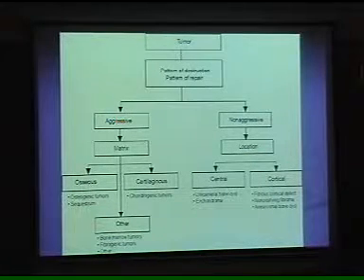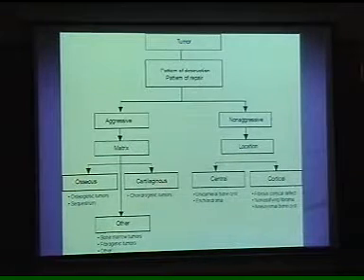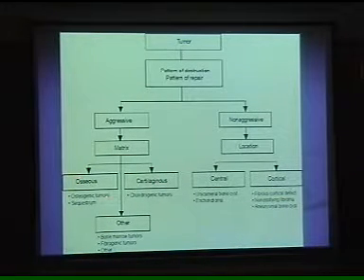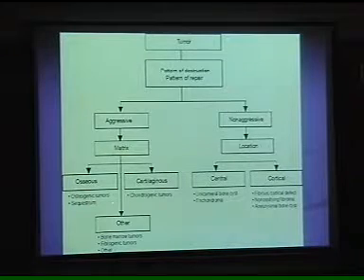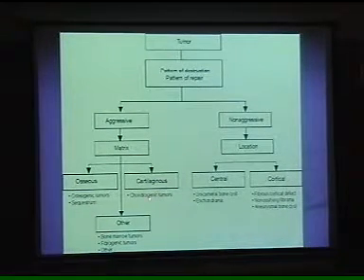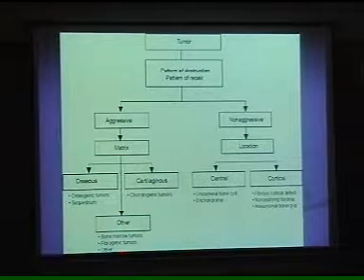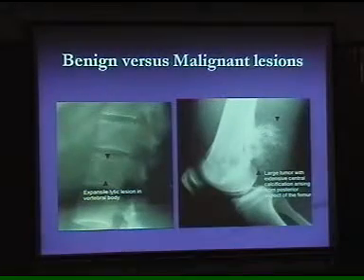But if you are suspecting this is aggressive, it may be matrix forming, it may be bony, or it may be cartilaginous. One of the two. If it's osseous, there may be osteogenic tumors, or a sequestrum in cases of infection. If it's cartilage, chondrogenic tumors, but predominantly they are having calcifications. And others are bone marrow tumors, fibrogenic tumors, and all varieties of tumors. From there you can assess it.